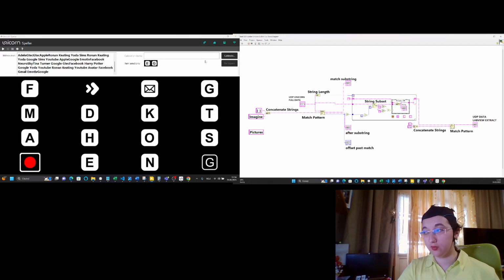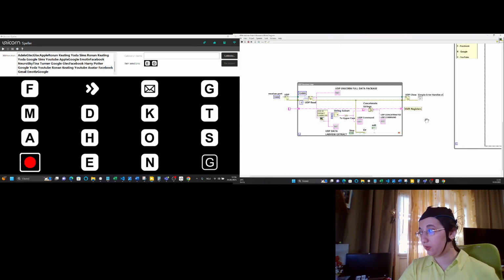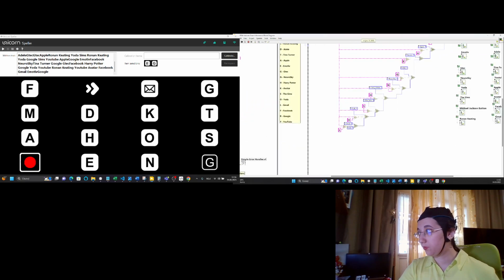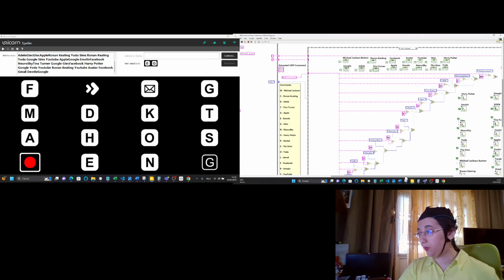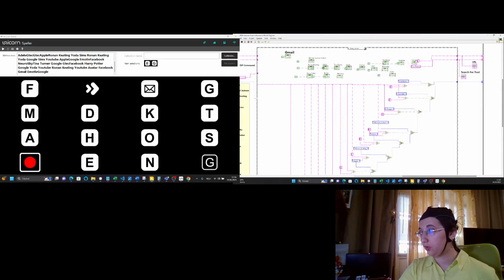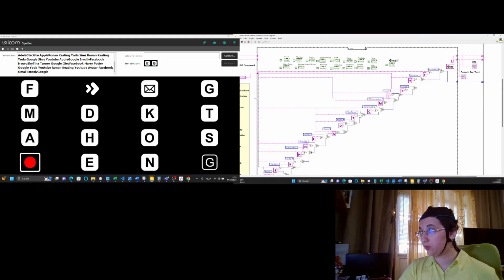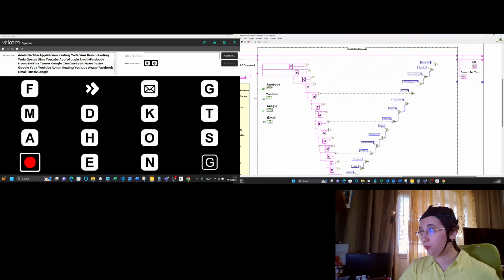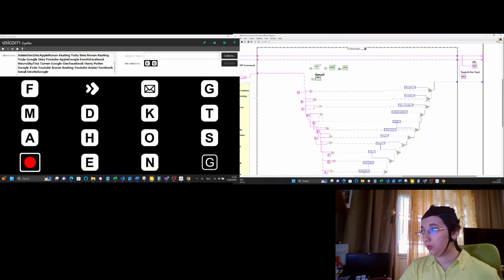for processing the UDP data and extracting the UDP based command related to a character that is further associated with some commands that will both display pictures and also will search for information in Facebook, YouTube, and Google.